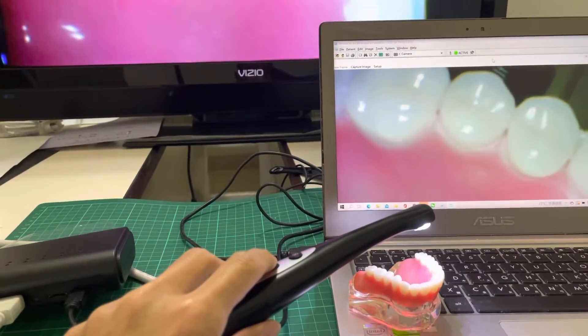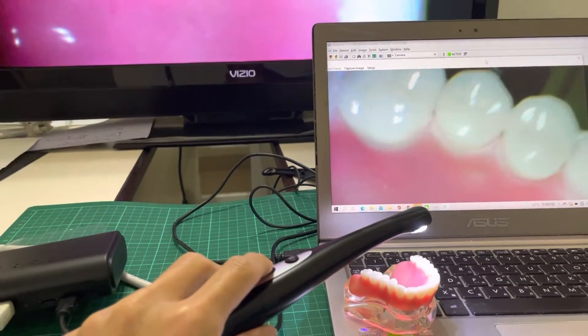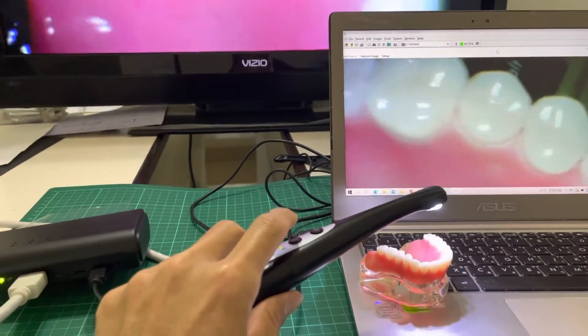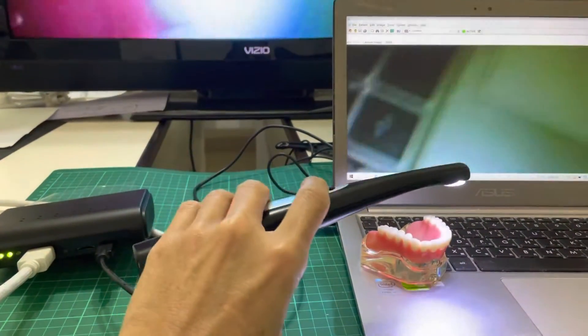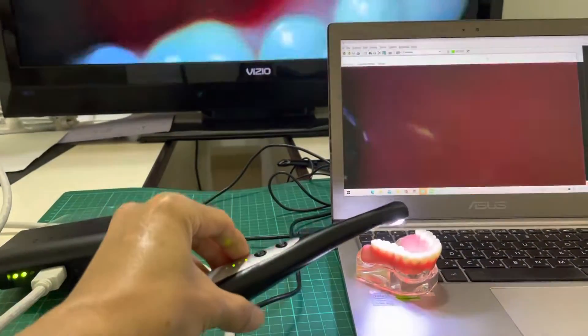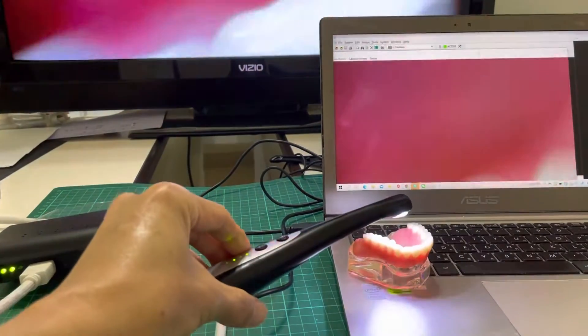This is engineer Tim from AppleTech. Let me introduce the new wireless intraoral camera from AppleTech. You can see this is the wireless camera here, with the Full HD image.